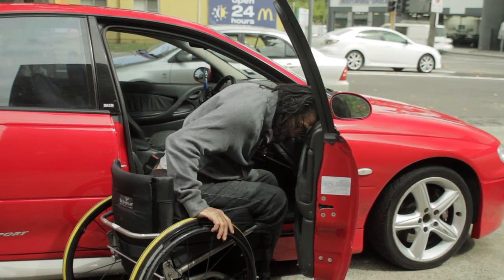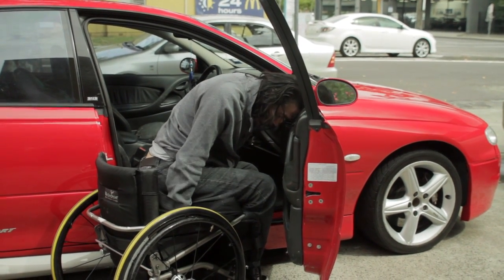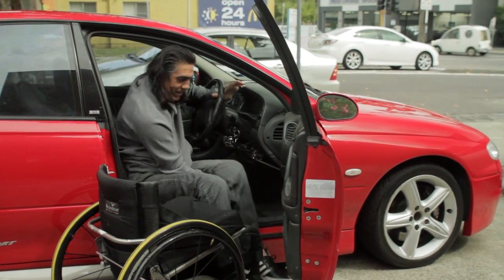So at first I just get to the edge of the chair as much as I can and reposition my hand on the cushion, and then just lock my arms and just sort of pivot my body across onto the seat. And the next step is just to get my legs in.